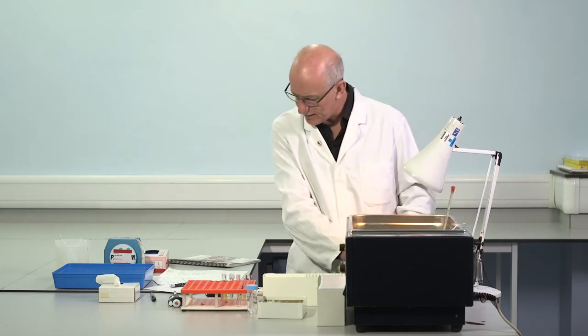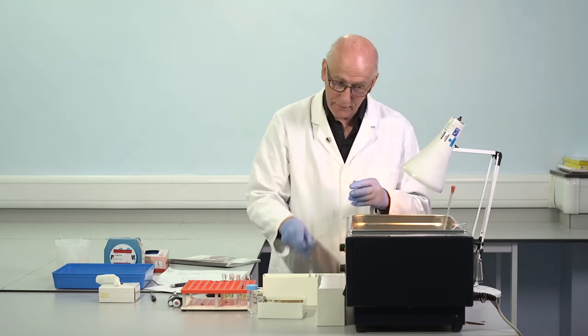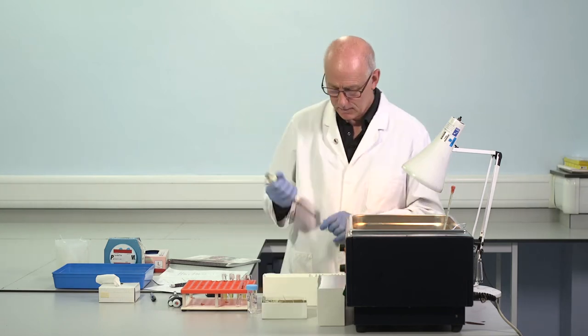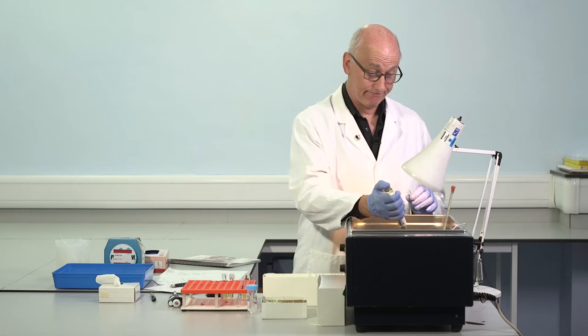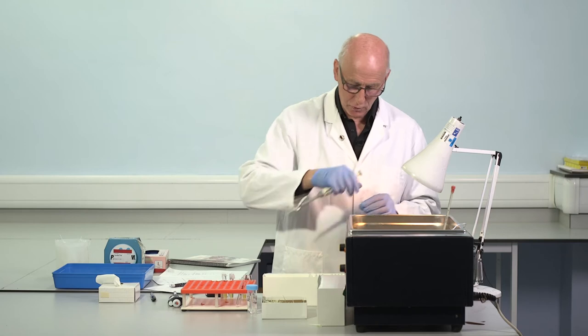Okay, so we've recorded the time on number 2. We're going to come back to reference range, but let's start number 3 whilst we're talking. Fresh pipette tip. Test plasma number 3. Guess what? Equal volume, 100 microliters, just warming up to temperature.